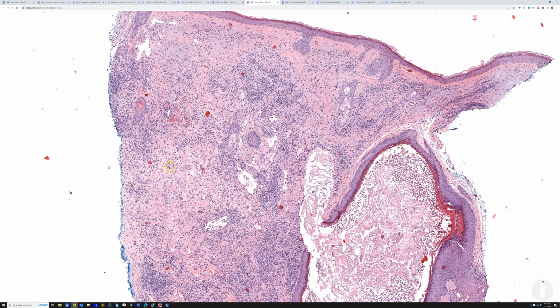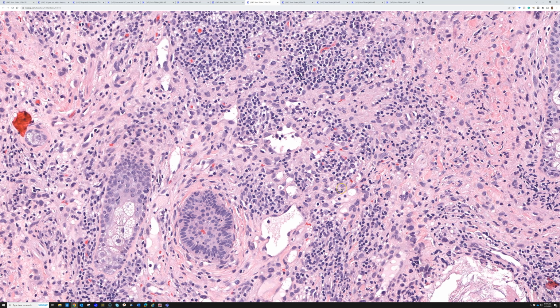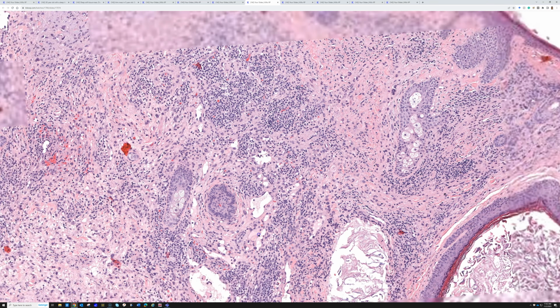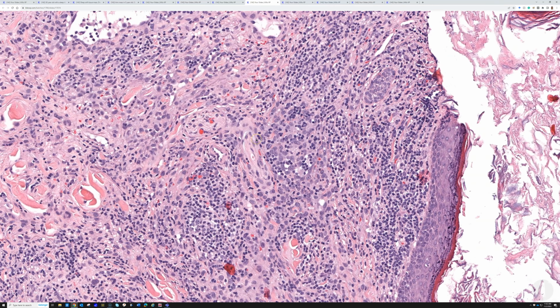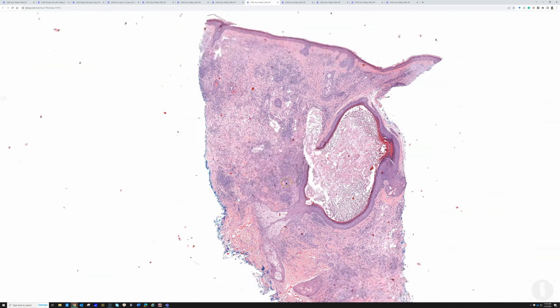And if we look closer in the background inflammatory infiltrate here, we see these kind of enlarged, slightly atypical cells. They're big, they look kind of pleomorphic, but not very cellular. They look kind of like histiocytes, which you would expect to see next to a ruptured cyst, right? But something about them is a little unusual. And there's also a lot of dilated telangiectasias here. So I have to tell you that I don't get credit for this case. My former colleague is the one who first saw this case and recognized these cells in the background. And she did a vascular stain. And let me show you what happened.